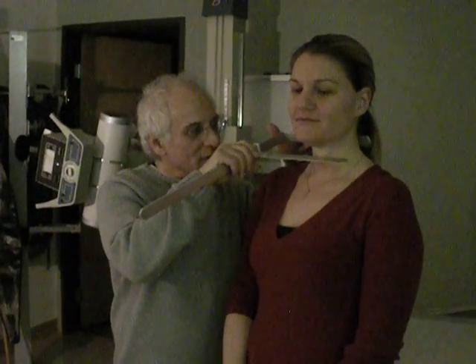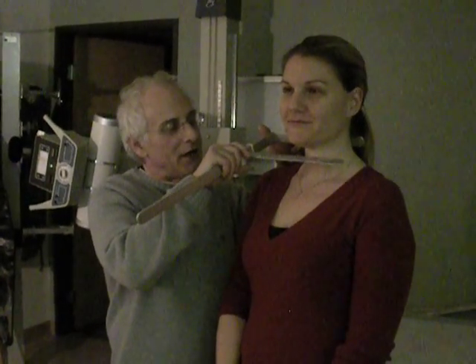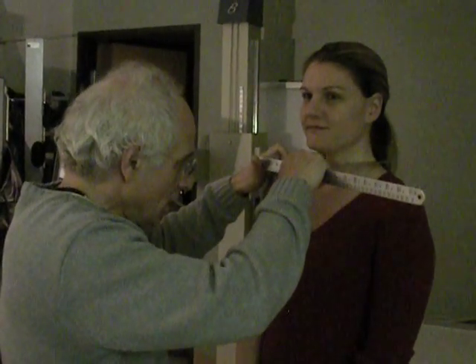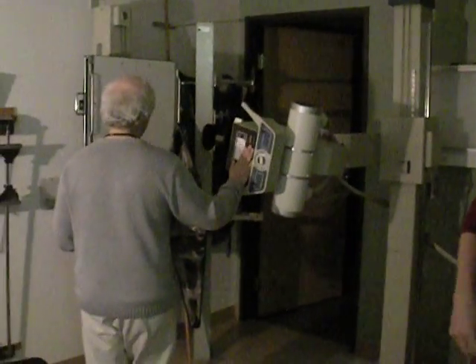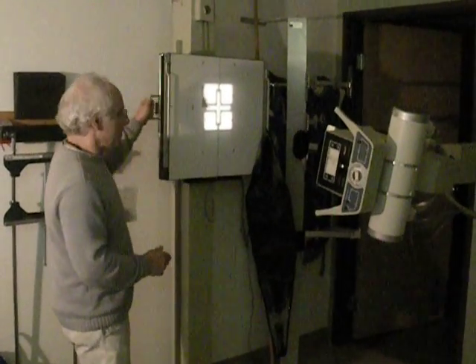And so we're going to measure this cervical spine through the thyroid cartilage. We'll call that 9, 10. Let's call it 10. And we'll measure it through the C5 or 6 or so, and we'll call that 10. And we're not going to take a measurement for the AP open mouth, we're just going to increase the kVp by about 5%. So now, having measured, we've set up our machine, and we've put a film in here.